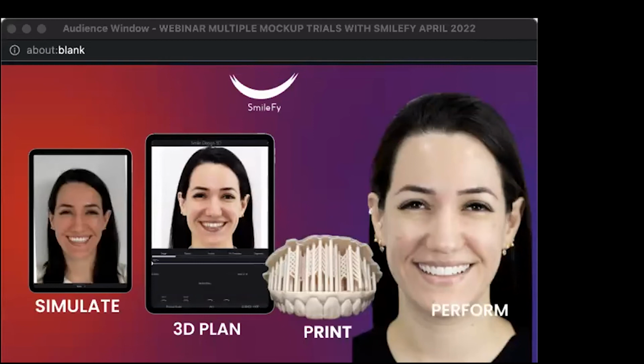You can 3D plan these cases using simple files, calibrating them together, and selecting different teeth shapes while reflecting that design into a digital patient to 3D print multiple wax-ups, and perform wax-up trials that will give the patient the best outcome possible for that treatment.